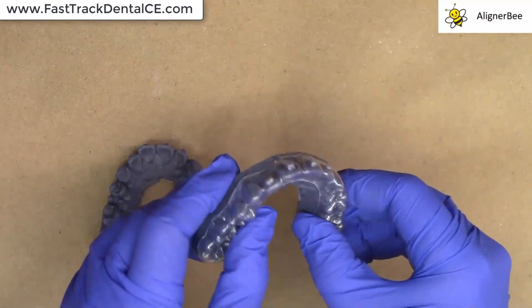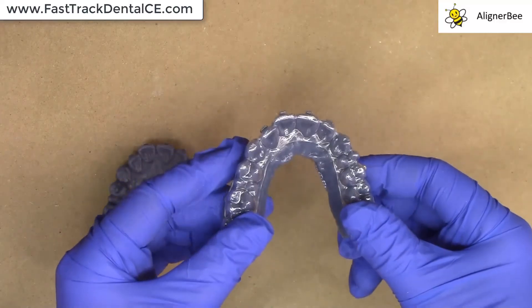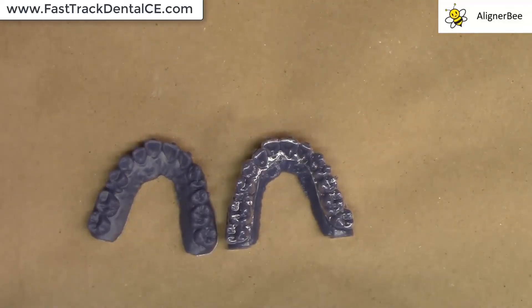I was able to achieve an excellent fit and adaptation in the new print orientation, allowing me to double check that there had not been any changes in the integrity of the prints, making sure that I could transition from horizontal printing to vertical printing in my patients currently in treatment using my ULAB software.